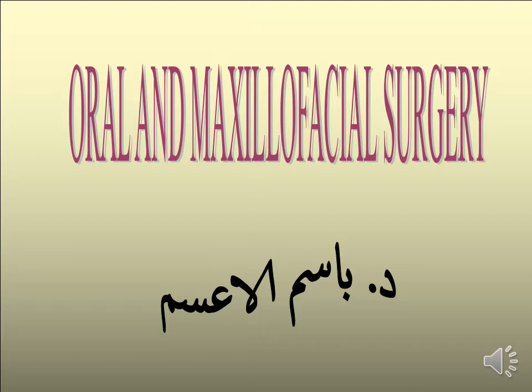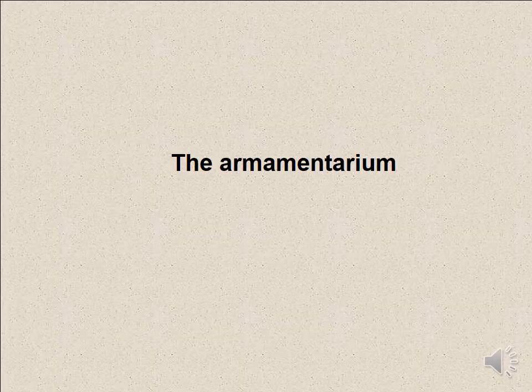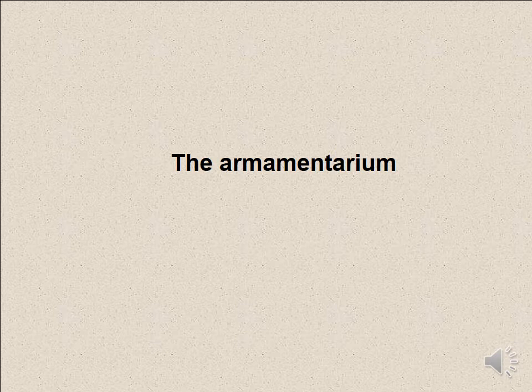Local anesthesia is an important subject in dentistry, so we concentrate on it. The topic that we discuss now is the armamentarium. The armamentarium means the instruments and materials that you use for giving a local anesthetic solution to the patient.